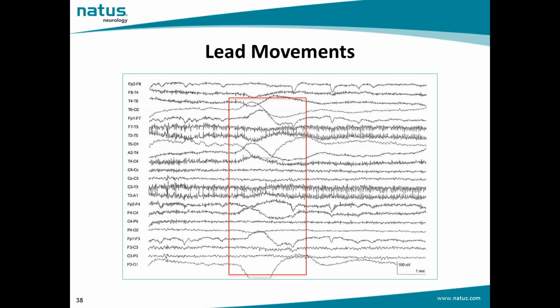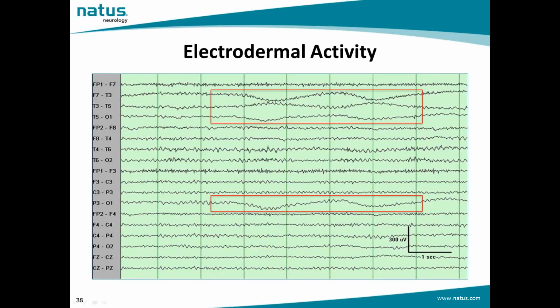Tremor artifacts are generated by tremor of the head or limbs, and the recorded activity is very similar to theta rhythm. Patients suffering from Parkinson's disease generally show the tremor artifact in the posterior regions, and when the tremor is localized on the hand, the artifact can be identified in the frontal regions.